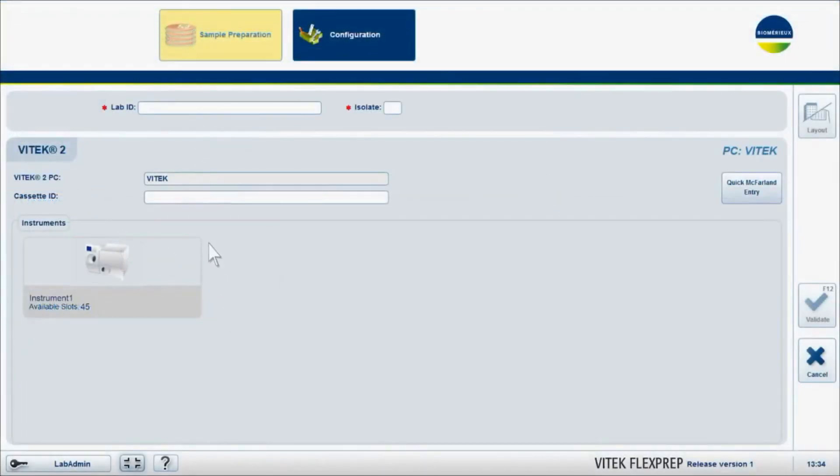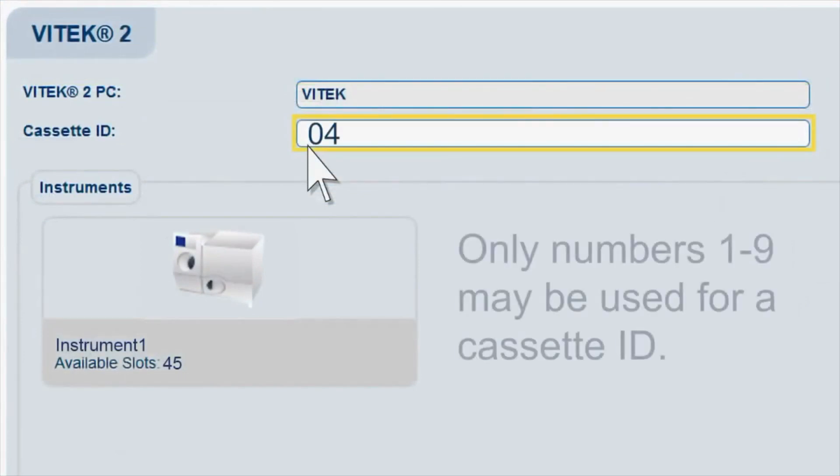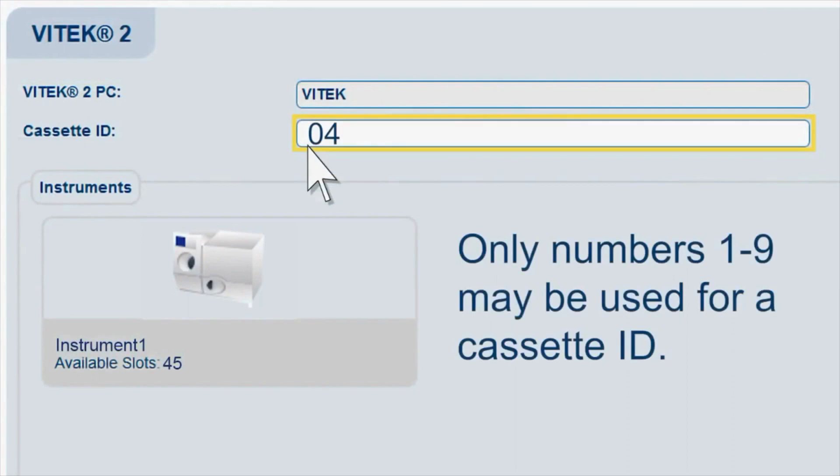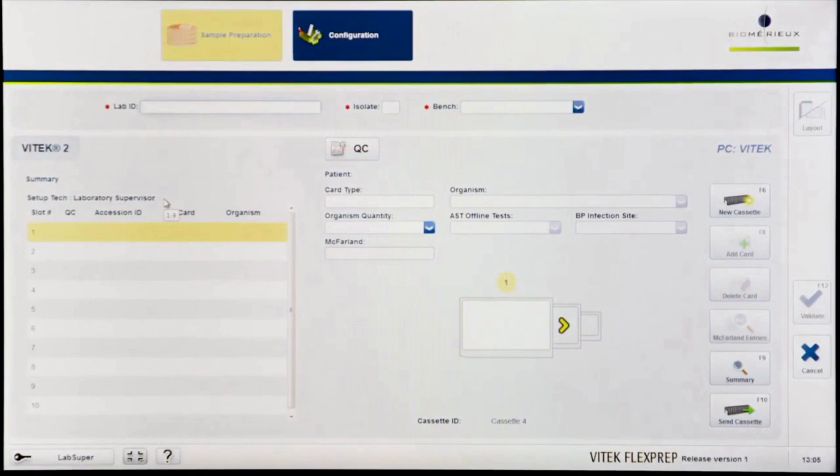Click in the Cassette ID field. Enter the desired cassette ID for the cassette in use and press Enter or scan the barcode located on the cassette. Only numbers 1 through 9 may be used for a cassette ID. There may only be one active FlexPrep cassette per cassette ID.